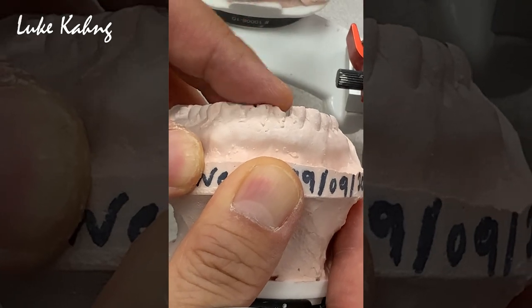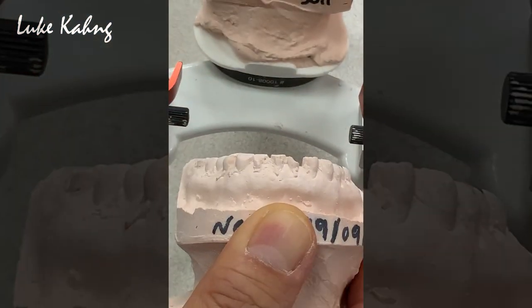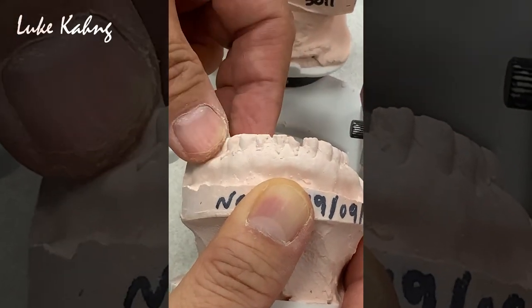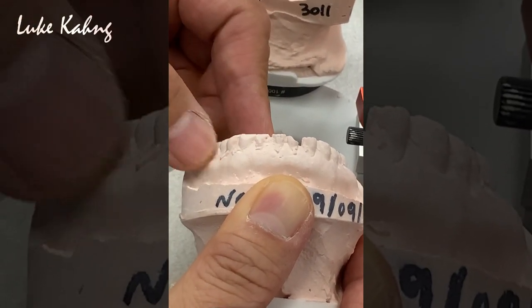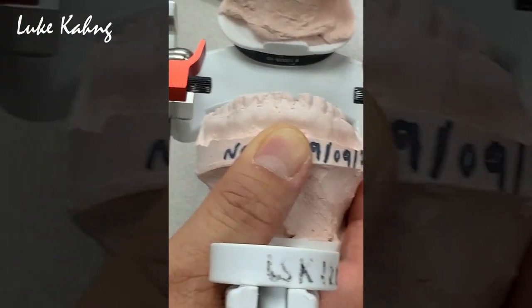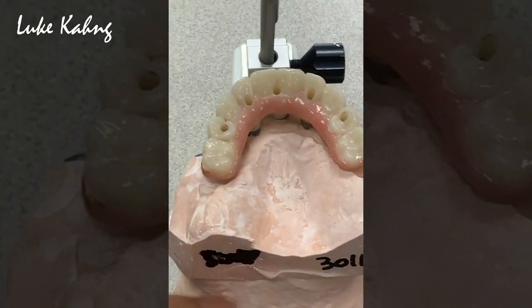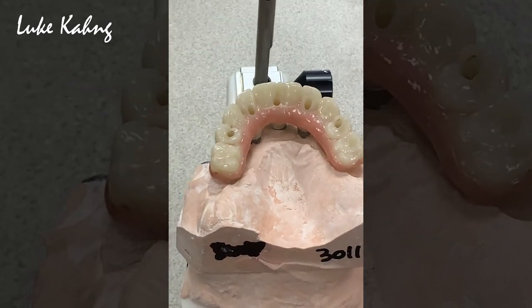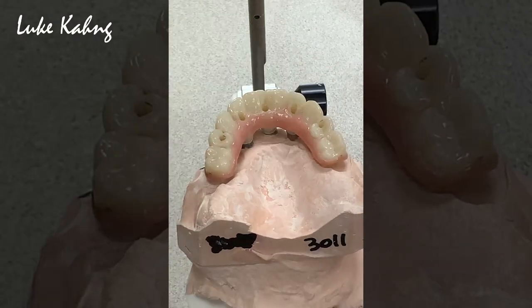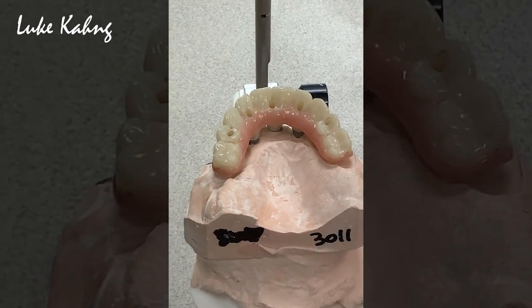And what would you use to increase it? So number one, inexpensive, acrylic, temporary. Number two, we make a rigid material, kind of like a dam splint, so they can wear it. Or they have to restore it. Unfortunately, they kept saying this one broke four or five times with the other laboratory. That's my solution. Otherwise, my restoration is going to break the same way. If I do exactly what they sent me, even though 7-star did it, it's going to break possibly because of the contact.